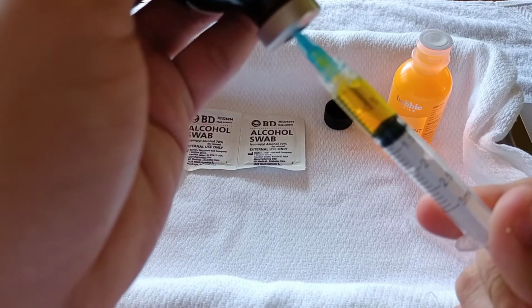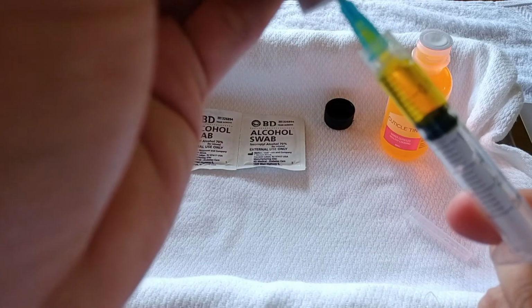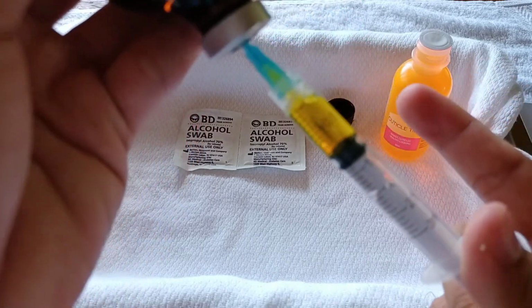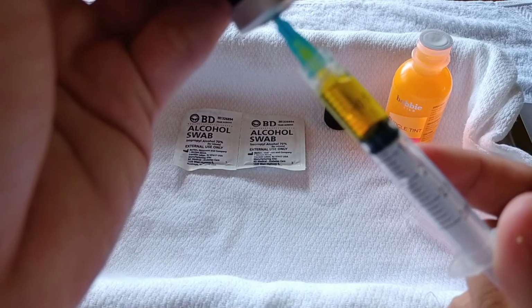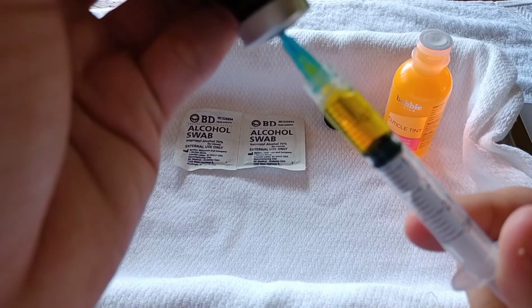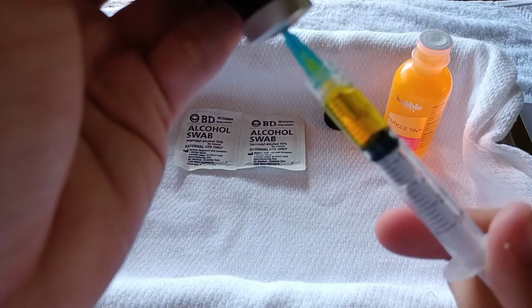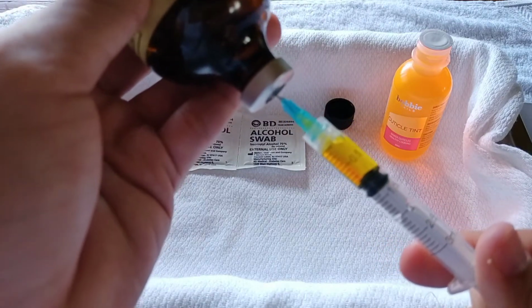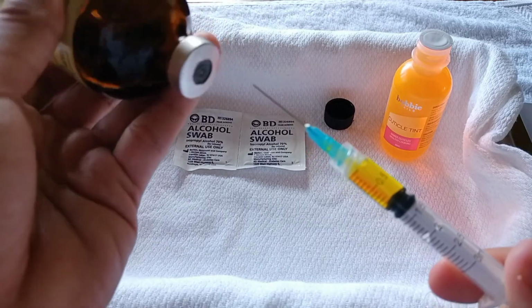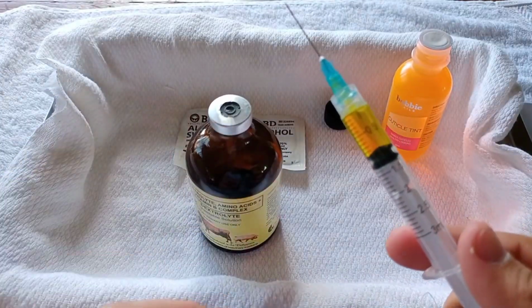Remove air bubbles when they appear. Gently flick the syringe with the fingers of the dominant hand. Keep a finger on the end of the plunger and continue holding the vial with the non-dominant hand. When no additional solution is needed, pull the needle out of the bottle while keeping the finger on the end of the plunger. Apply the needle to the syringe if IM, sub-Q or intradermal injections will be needed.